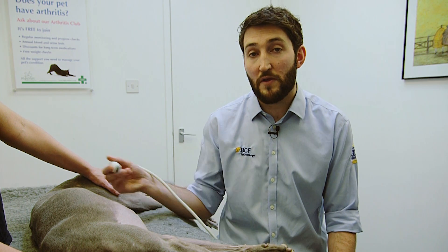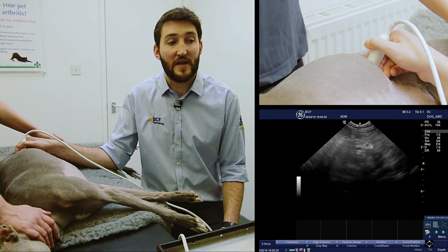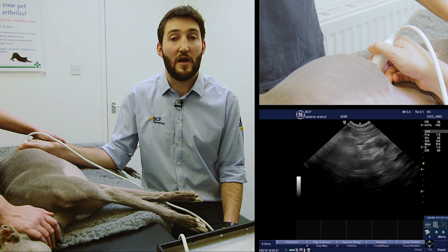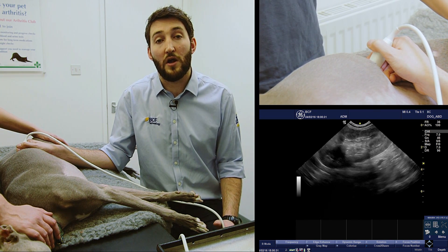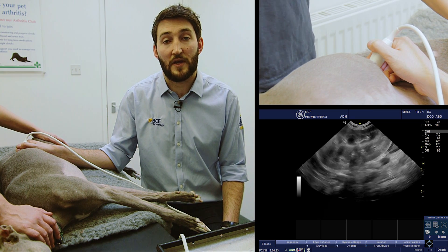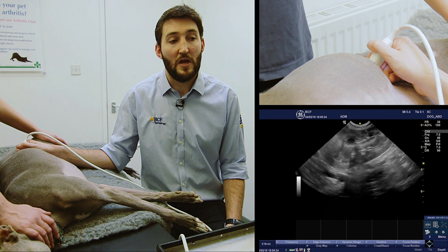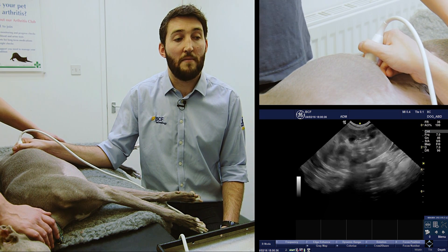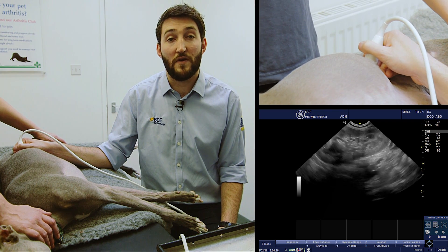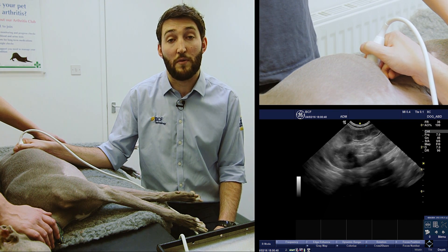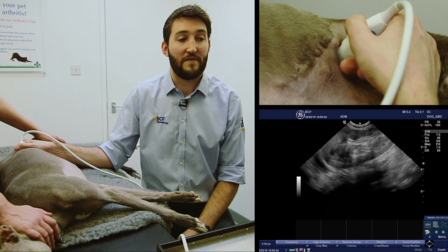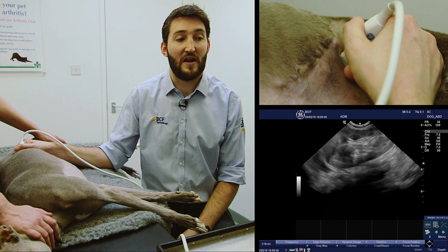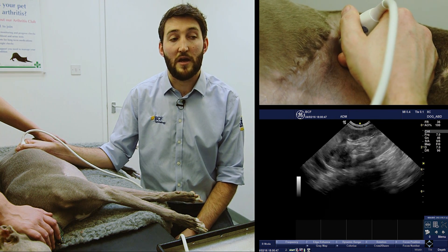To scan the left adrenal gland we're going to start where we would for the left kidney. If you're not comfortable scanning the left kidney, please take a look at our earlier video on kidney scanning technique. With the probe in a longitudinal plane and held fairly vertically upright, scanning from above down towards the table, we locate the left kidney — a little bit of fanning brings it into the image.